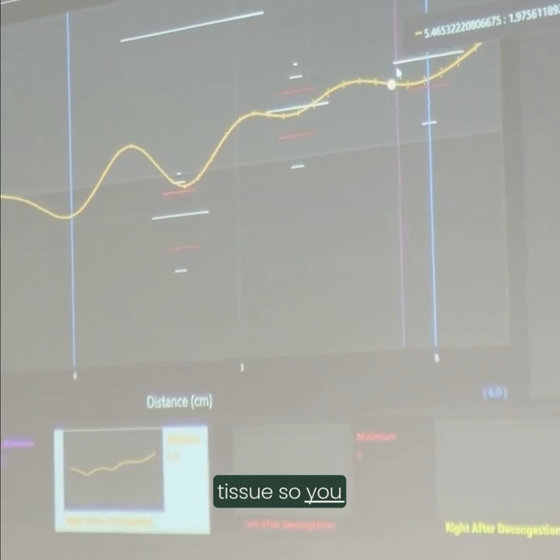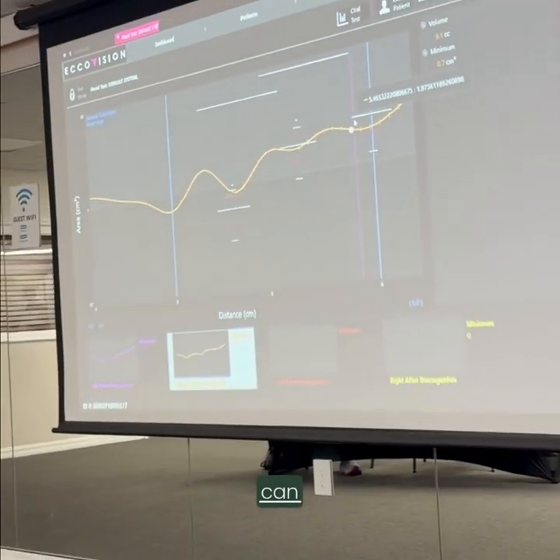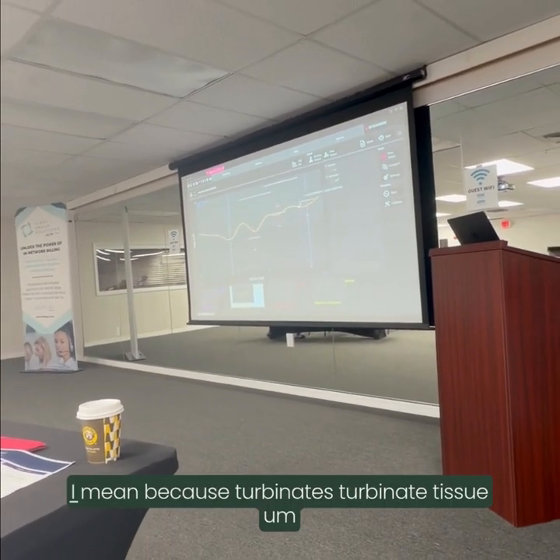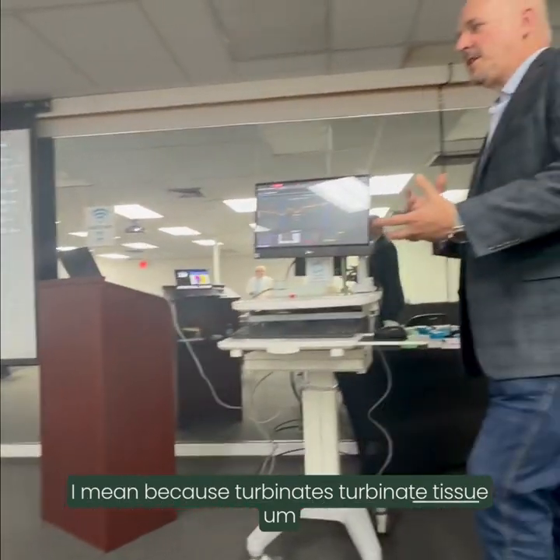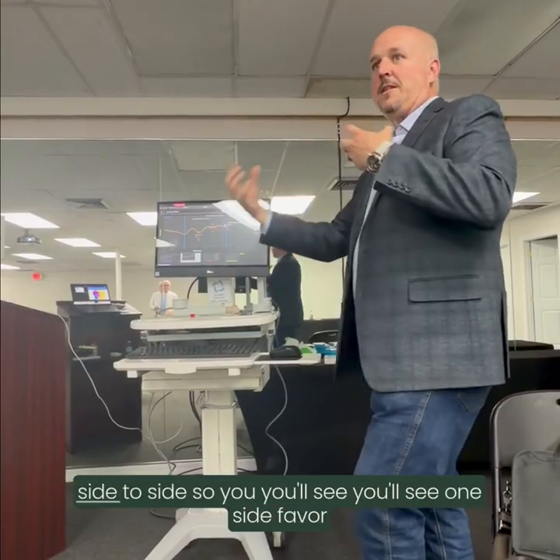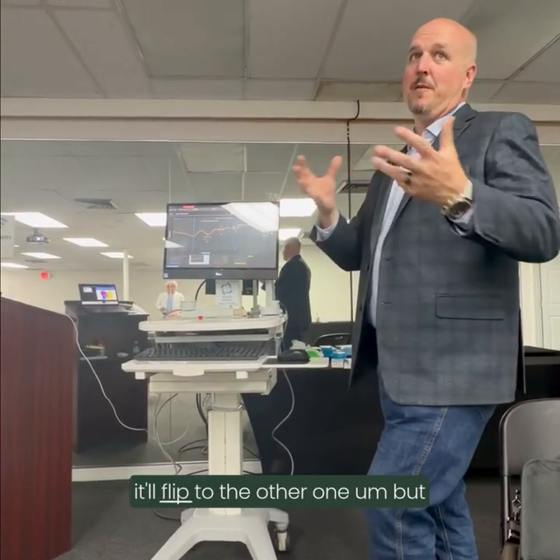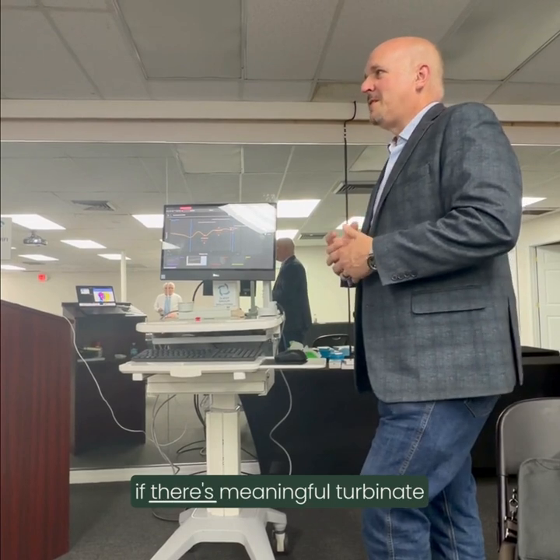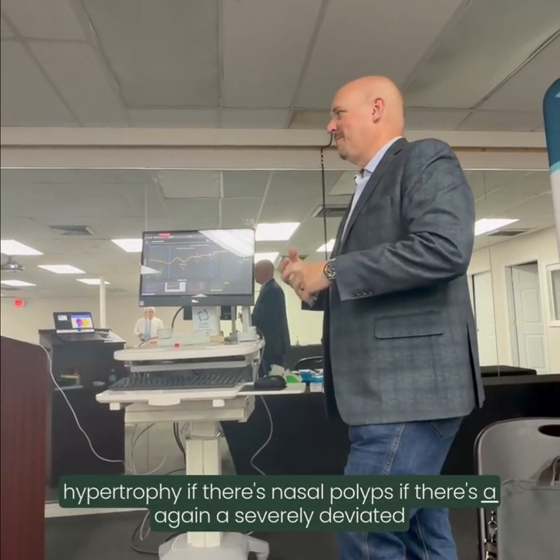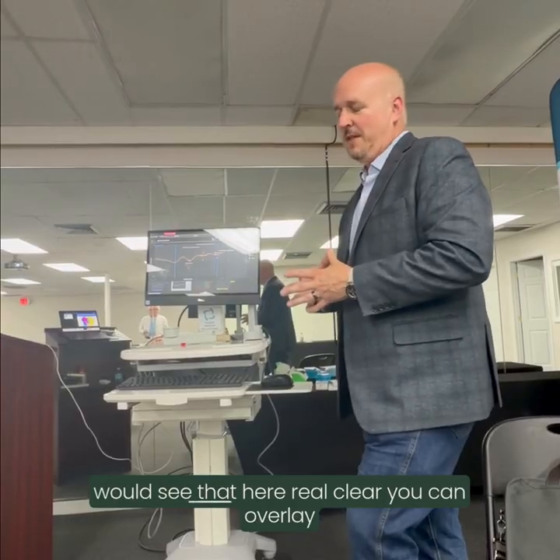And that's the big question: is it a valve issue, or are the turbinates hypertrophic? It's not usually the septum, it's usually the turbinates. Can we get a pretty good feel for turbinate hypertrophy on these things or not? You can, because turbinate tissue swells, right? It cycles and swells side to side. So you'll see one side favor over the other, and then a couple hours later it'll flip to the other one. But if there's meaningful turbinate hypertrophy, if there's nasal polyps, if there's a severely deviated septum occupying space on one side, you would see that here real clear.